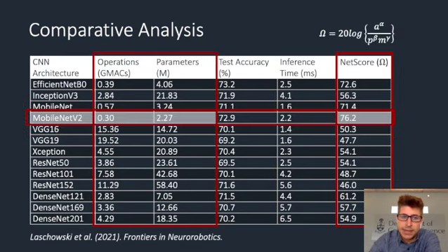And finally, our analysis showed that the MobileNet V2 network, which was also developed by Google, is able to achieve the best net score. Now, net score is a new operational metric developed by one of my colleagues that uniquely balances the classification accuracy with the computational and memory storage requirements of the neural network, which can be important for onboard real-time inference with mobile and embedded computing devices.